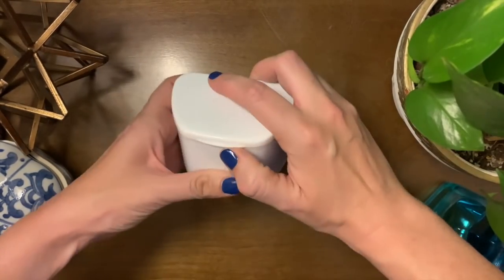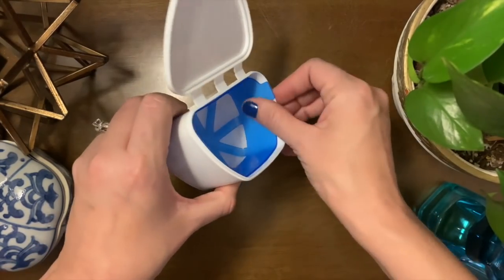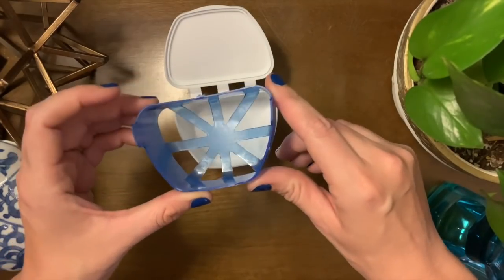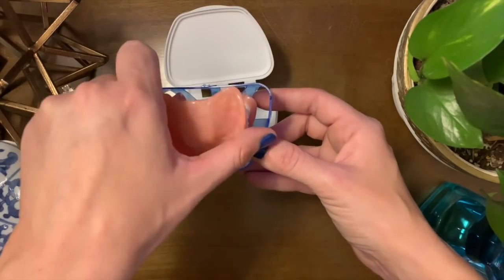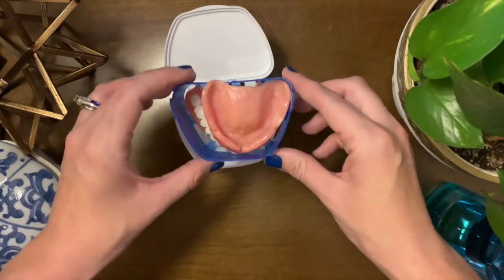It doesn't have to be fancy, but if you want to be bougie, you can pick up a sonic cleaner and that'll really clean your dentures. Look it up on Amazon — they've got them on sale there. This denture bath comes with a little tray that you can set your dentures in, because the struggle is real: dentures are extremely slippery when they're wet. They will pop out of your hands and you will break them.